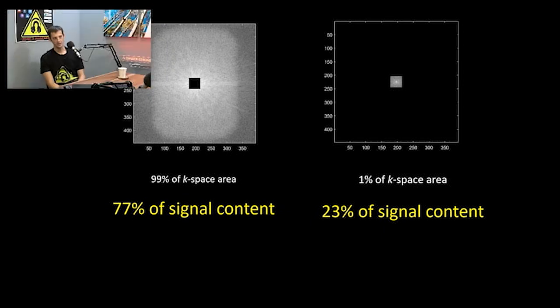That's the wild thing about Kspace: one pixel in Kspace affects every pixel in image space. That's right, and it's actually vice versa too. One pixel change in image space will affect every pixel in Kspace. That's why I used white pixel noise to demonstrate it: you can change that one pixel and see that it really changes everywhere. I think that's the hardest part to wrap your head around.